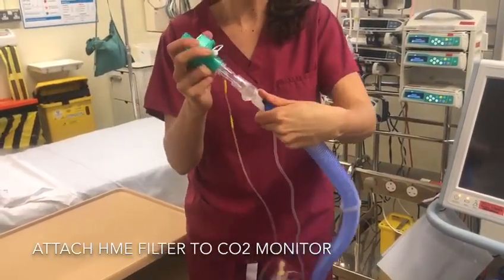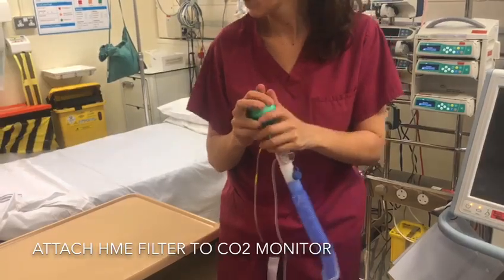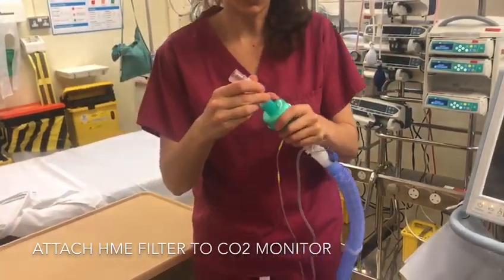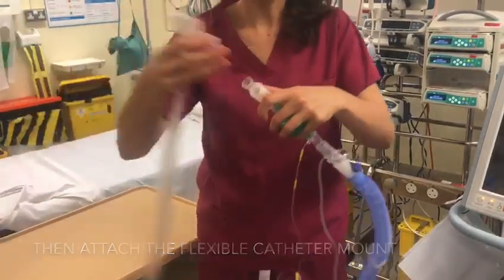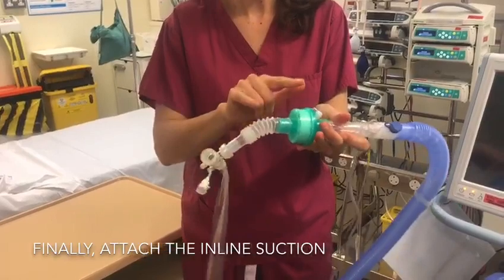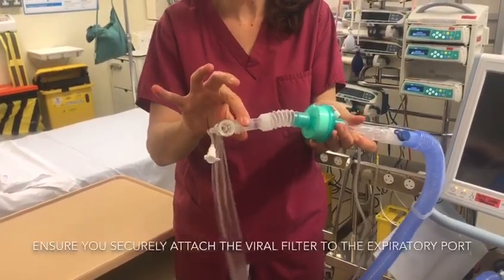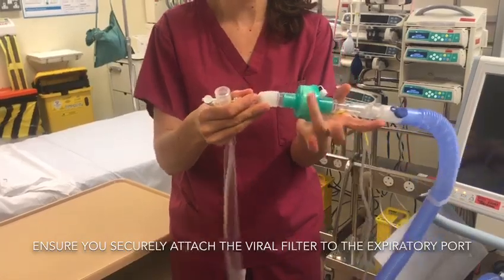In theatres, you may have your CO2 monitor directly into this port here. We then have our flexi tubing and the inline suction to the patient. You can put your filter directly onto the inline suction, but if you're proning your patient, you want some give in the tube to stop getting sores from the HME.